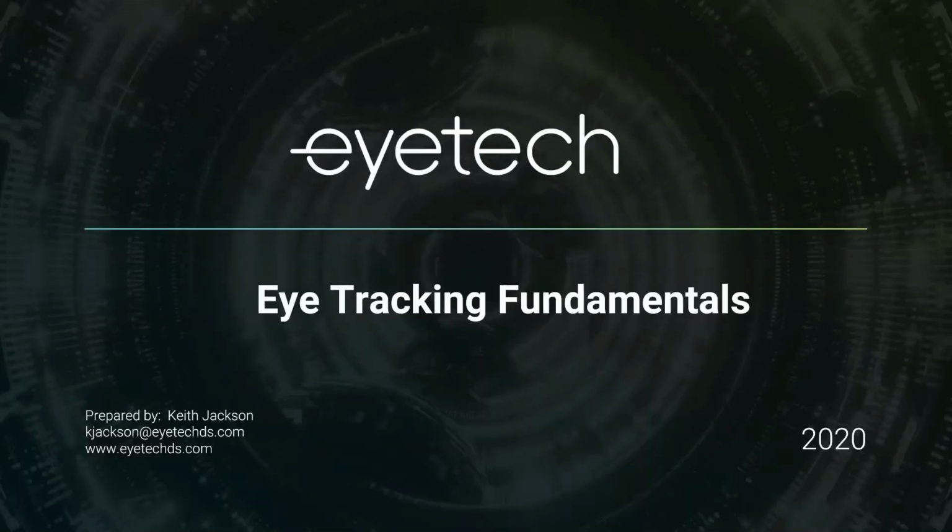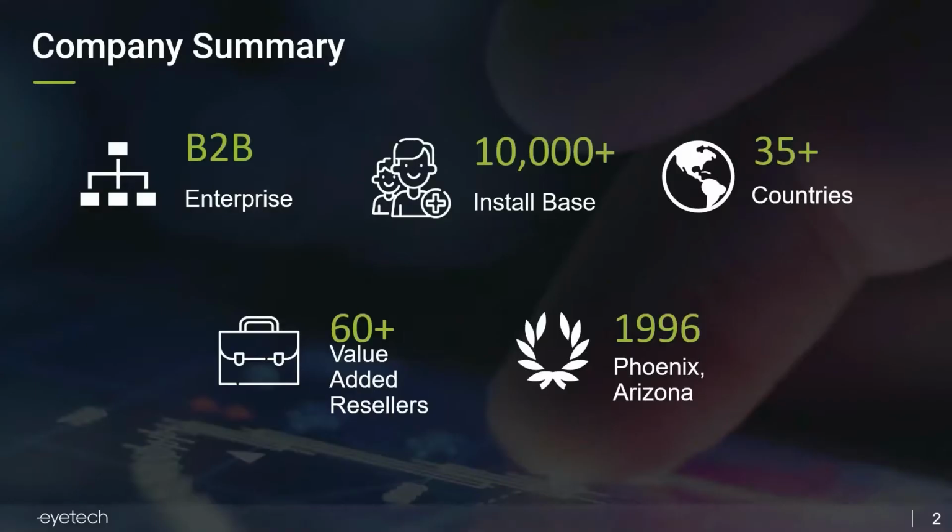Okay. So we're going to go over eye tracking fundamentals today, and later on, Frazer will do a deeper dive live demo of the AcqKnowledge integration with our eye trackers. We're really pleased to have partnered with the BIOPAC team to integrate with our API into their great platform.